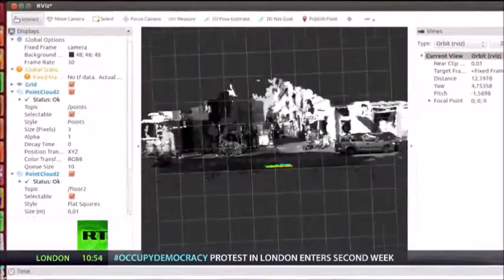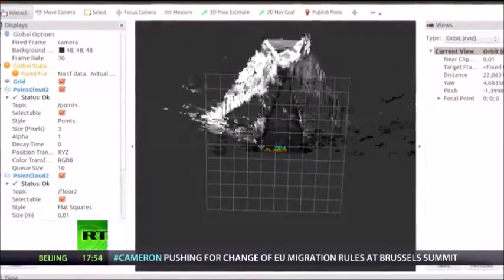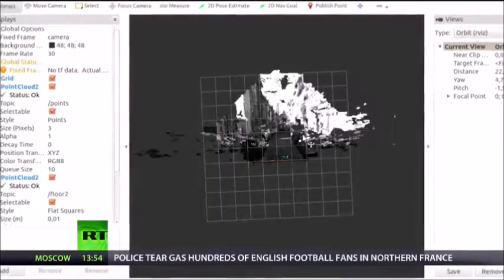As well as working closely with members of the blind community, the team took existing 3D data to test out the recognition algorithm, which scans a vertical field of view directly in front of the user. It was tested out on the road, the theory being it would have no problem dealing with obstacles moving at walking speed on the pavement.